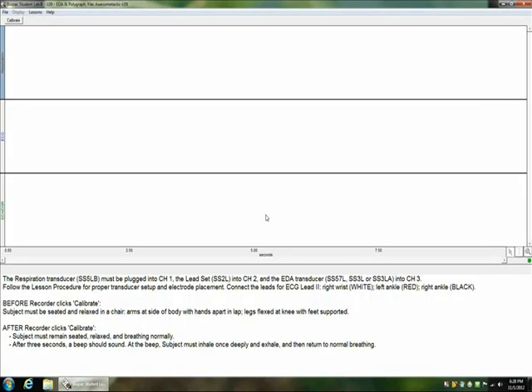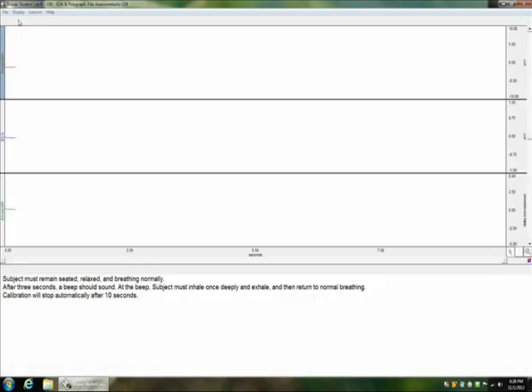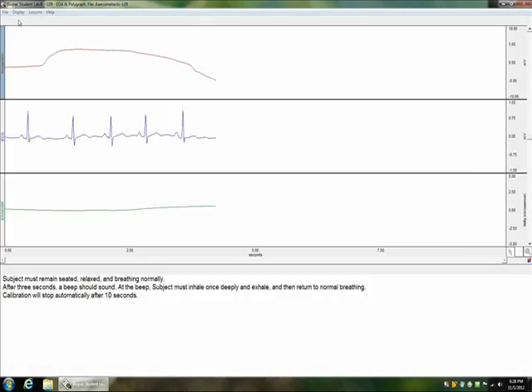Now, before we calibrate, we're going to want to make sure our subject knows what they're going to do during the calibration. So the subject is going to take one deep breath once the calibration starts, exhale, and then continue breathing normally for the rest of the calibration. Once they know this, you can go ahead and click Calibrate and the calibration will begin.